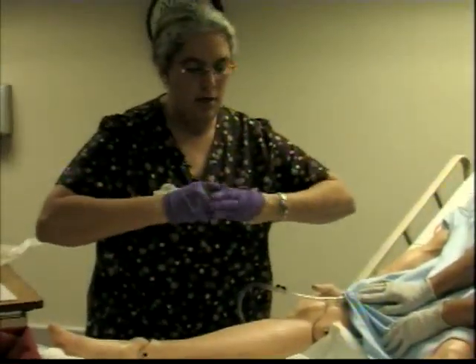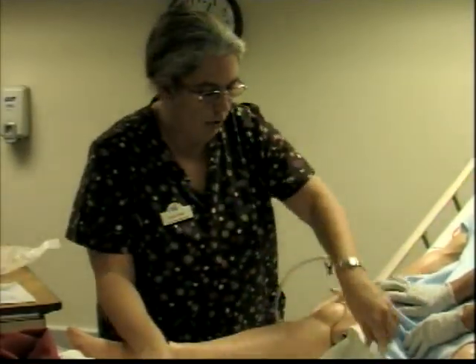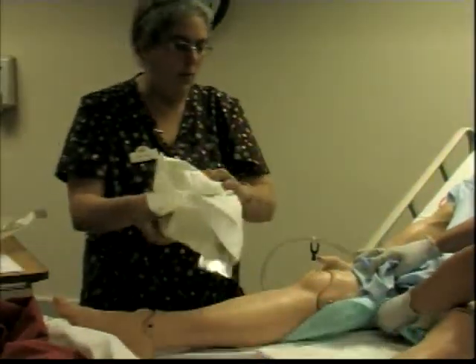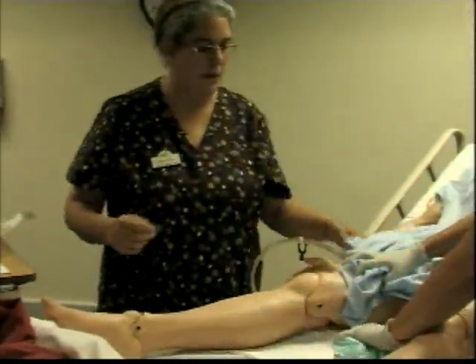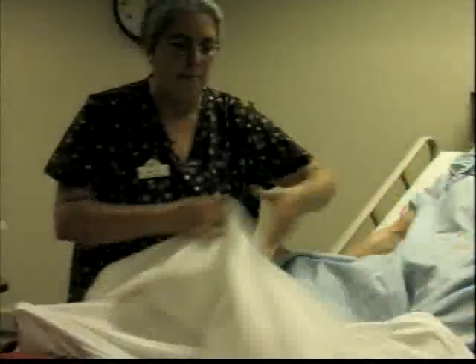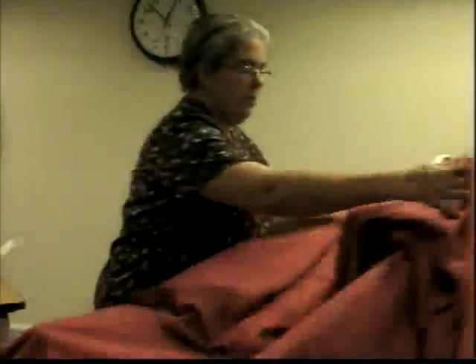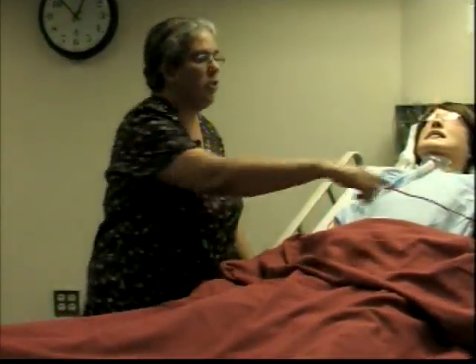Remove your gloves, gather all your supplies, and put them in the red bag. Cover the patient back up and make the client comfortable. Ask if she has any discomfort or cramping — sometimes the bladder can spasm and clients feel cramping. Make sure you leave her in a comfortable position and put the rails up.